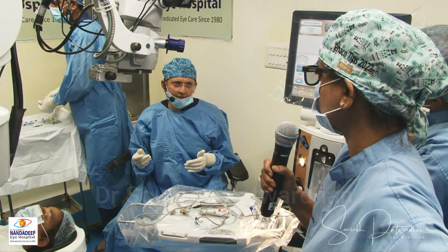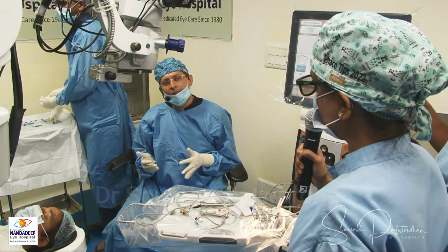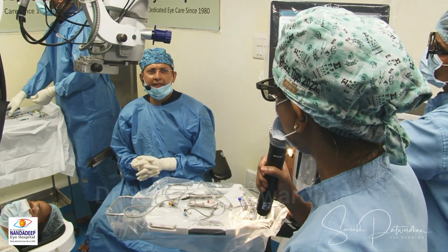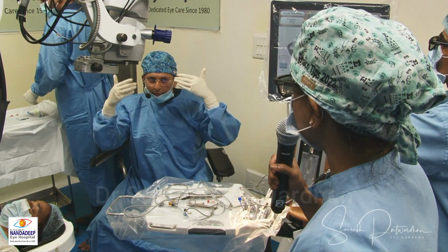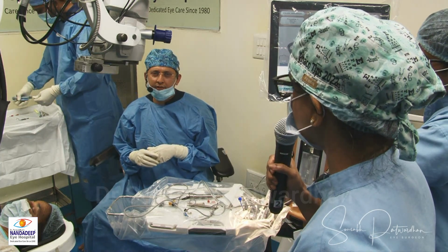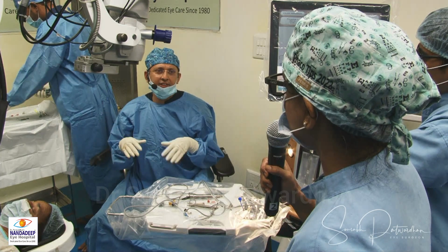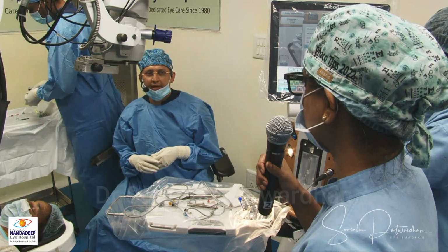Does patching for 2-3 hours in the immediate post-op help in the prevention of rotation? I have not tried, because even with patching, the eye will move inside because the other eye is open. So then we have to patch both the eyes to stop the eye movement. So maybe if we ask the patient to avoid any jerky movements, like squeezing the eye in a bus or something like that, might cause this.